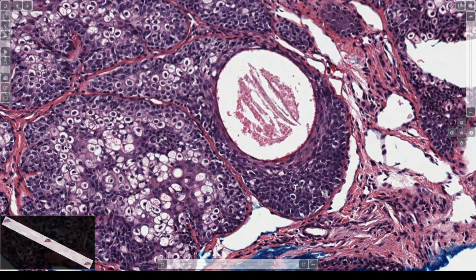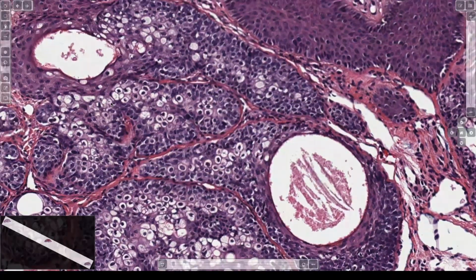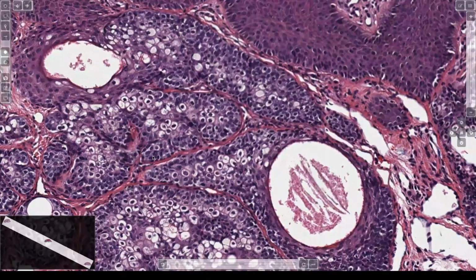It's the same kind of rule I use for sebocytes as I use for lipoblasts, okay? In the soft tissue, an atypical cell that's in a mesenchymal tumor that has clear bubbles and indents the nucleus, those are lipid droplets and it's probably a lipoblast. In an epithelial tumor, bubbles that indent the nucleus usually are gonna be sebaceous. I do see squames that are vacuolated that seem to just be squames and not sebaceous that do actually have true bubbles though. So I've come to doubt myself over time with that. But anyway, this I think is a sebaceous adenoma.